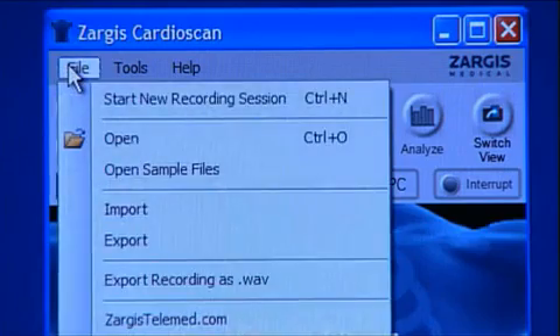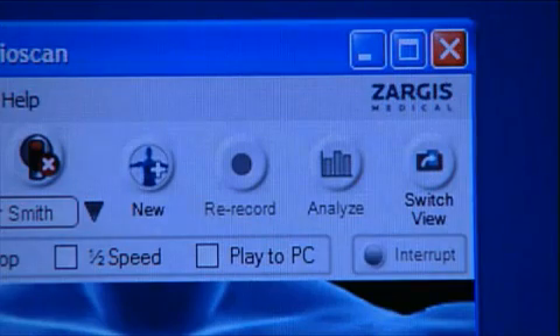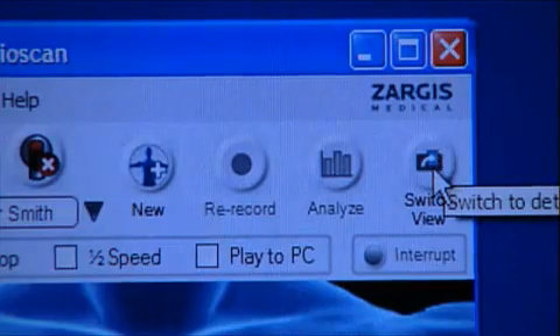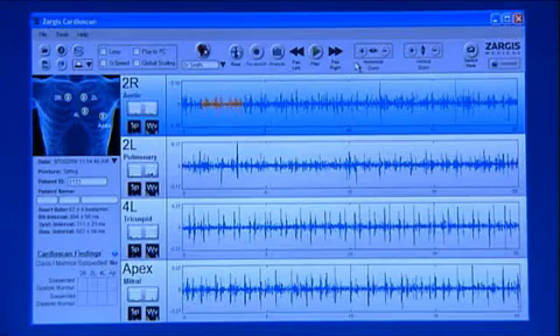The sound files can also be exported to a WAV file format, which can be played on most PC media programs, such as Windows Media Player. For a more thorough analysis of the recorded sound files and the Zargis CardioScan software analysis, click the Switch View button located on the upper right-hand side of the software screen. This will launch the Zargis CardioScan software detailed view screen.